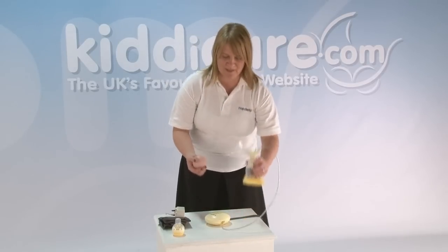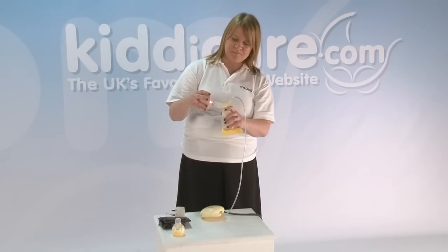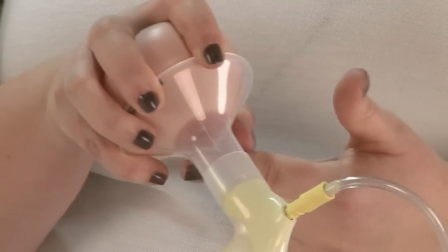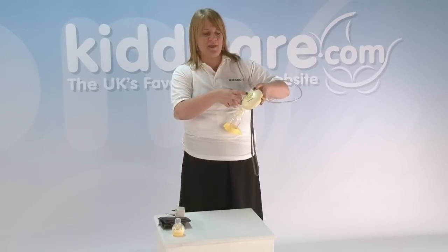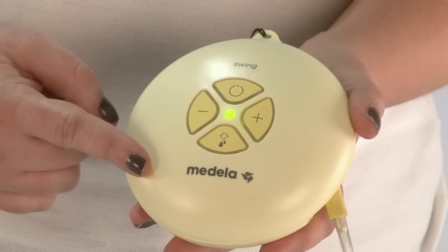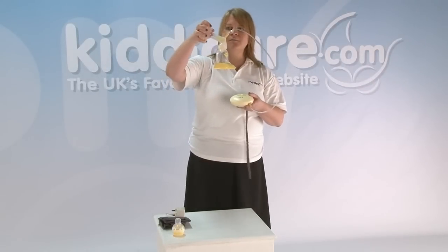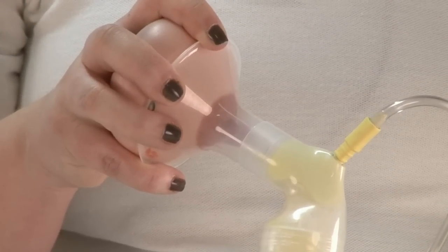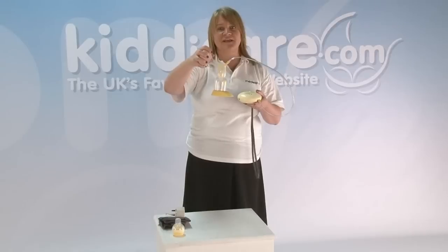So with the Swing, what we need to do is ensure that mum positions herself with the nipple as centrally as possible in the breast shield. To turn it on, you press the button at the top here — that's the on and off. If I press that now, you'll see that the green light starts to flash. The pump is doing rapid sucks — we call this the stimulation phase, and that's the first part of our two-phase expression.